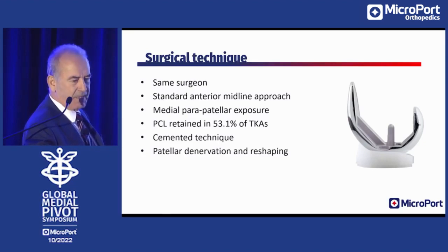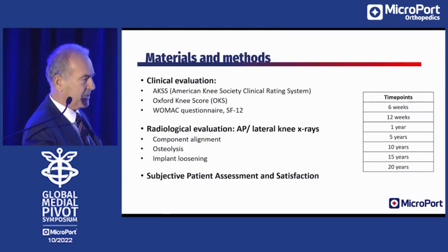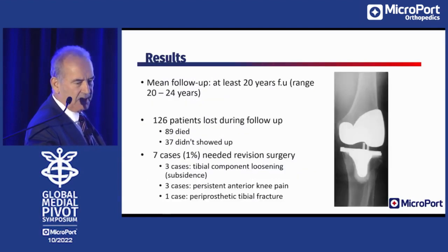And we used cemented technique and patellar non-replaced, just denervation and remove the osteophytes. Clinical evaluation, the American Knee Society score, the Oxford Knee score, the WOMAC, radiological evaluation, component alignment, osteolysis, implant loosening, and subjective patient assessment and satisfaction.